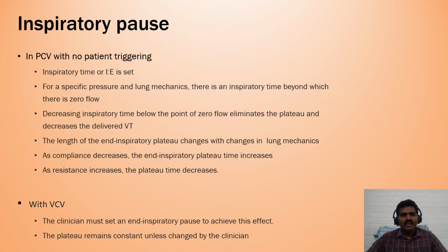Inspiratory time in PCV with no patient triggering: inspiratory time or IE ratio is set. For a specific pressure and lung mechanics, there is an inspiratory time beyond which there is zero flow. Decreasing the inspiratory time below the point of zero flow eliminates the plateau and decreases the delivered tidal volume.